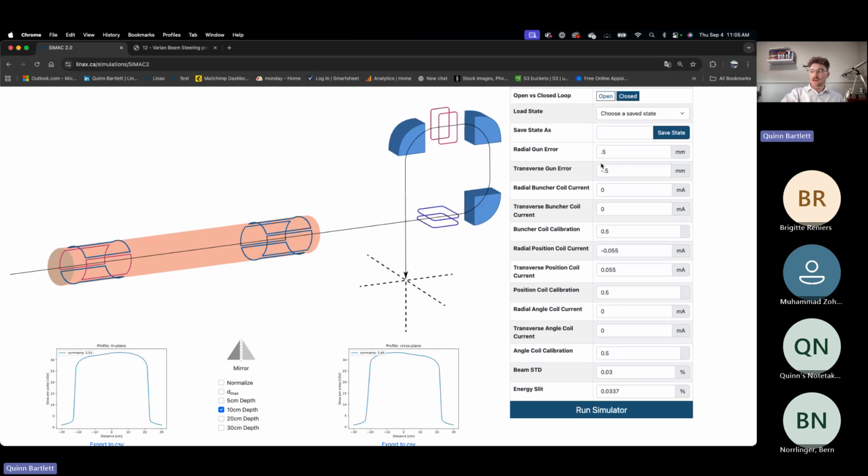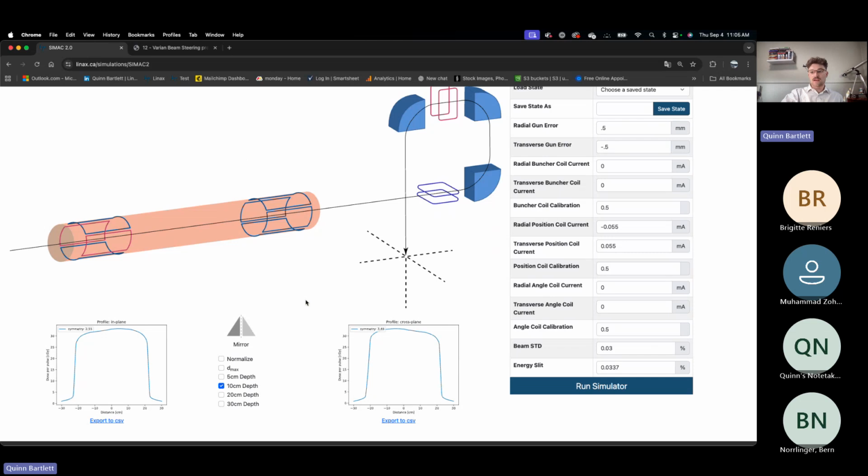And so obviously that has to do relative to the positive and the negative that I applied to the error. And we can check out at Dmax, kind of our most useful output. But then of course you can check it at any of these depths. You can also normalize them to each other, which again in this case isn't very useful.